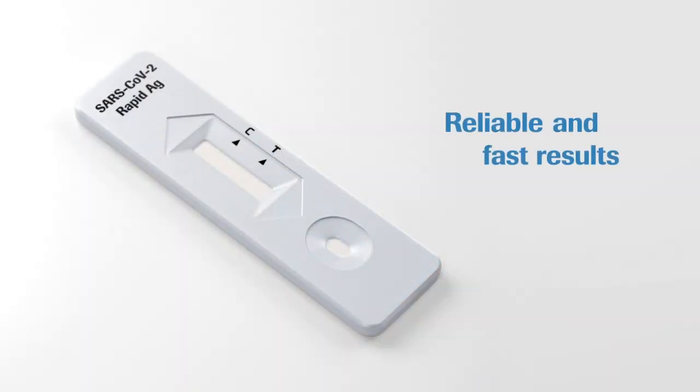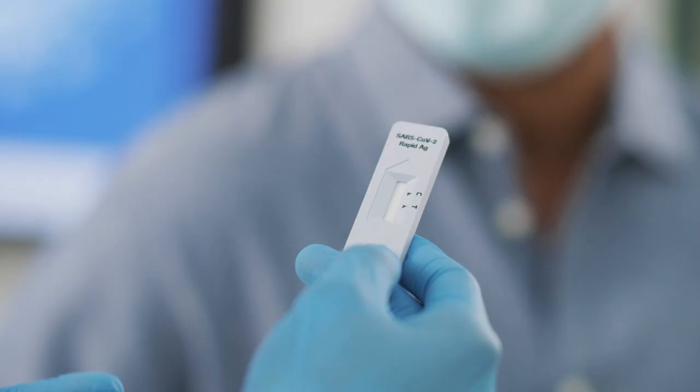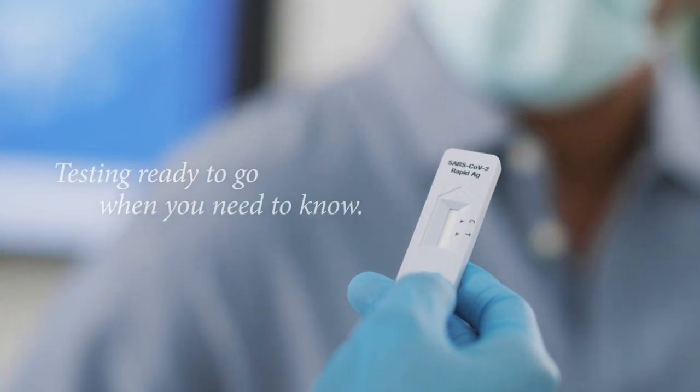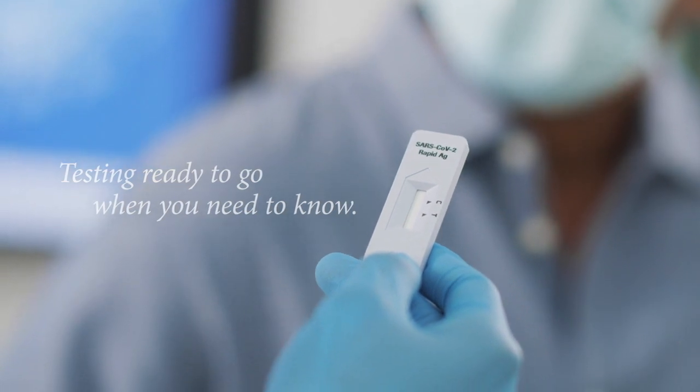The SARS-CoV-2 rapid antigen test from Roche Diagnostics offers reliable and fast results wherever they are needed. In uncertain times, your greatest asset is knowledge. It is time to expand testing with the Roche SARS-CoV-2 rapid antigen test because patients and their communities need to know.